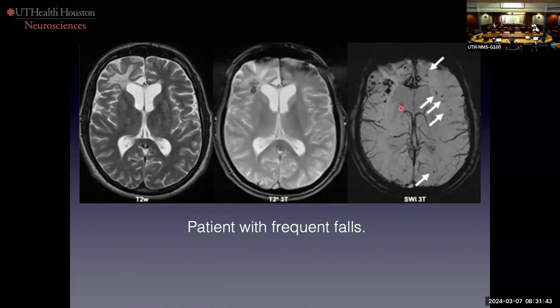This is an SWI — susceptibility weighted image — which has five times increased sensitivity for hemorrhage inside the brain. At its base, the root pulse sequence is a GRE, but we're layering on top of it phase-sensitive information. So sensitive that we can see deoxyhemoglobin, because it has magnetic susceptibility.